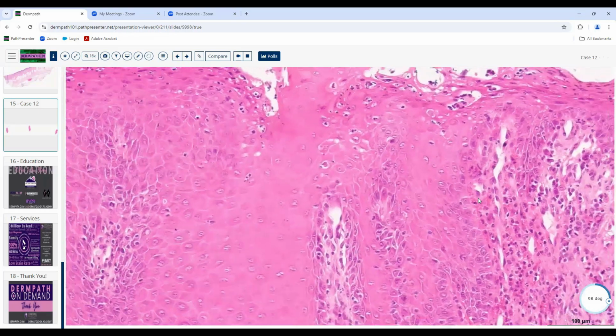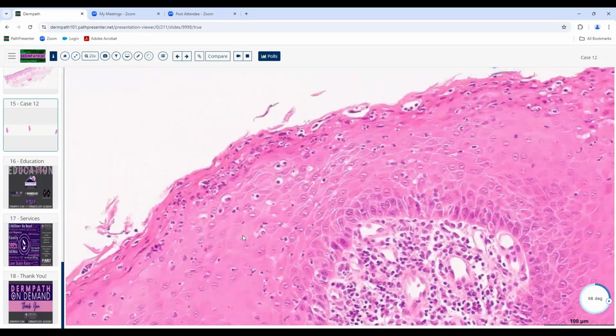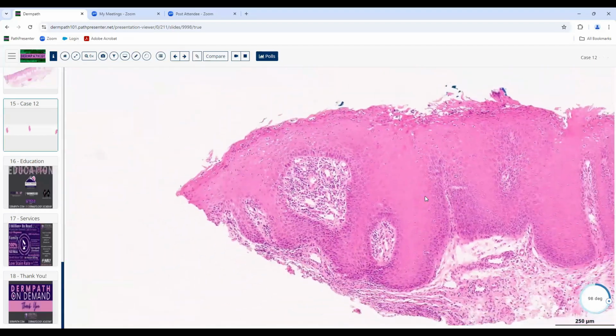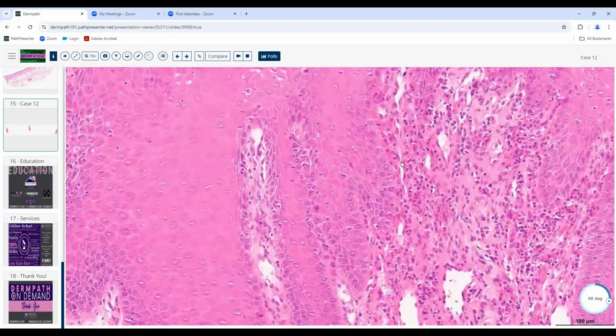And so whenever you see something like that, do not jump to the diagnosis of cancer. What we do when we see this, we sign this out as verrucous candidiasis. We recommend treating the candidiasis first, get rid of that, and then seeing what happens. And in many cases, this stuff just vanishes. It's mostly pseudocarcinomatous hyperplasia. You can get an occasional mitotic figure in pseudocarcinomatous hyperplasia. It's pretty rare to see frank cytologic atypia in pseudocarcinomatous hyperplasia. That doesn't mean that they've got cancer.